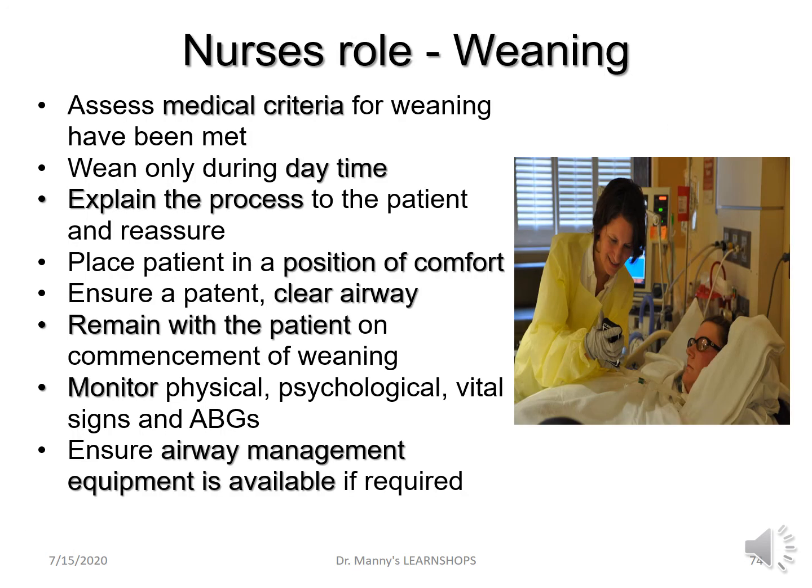The nurse's role in weaning is to assess the medical criteria for weaning and that they've been met. Weaning should only occur during the daytime when there are lots of healthcare providers around, nighttime not. Explain the process to the patient and reassure them you're a patient advocate.